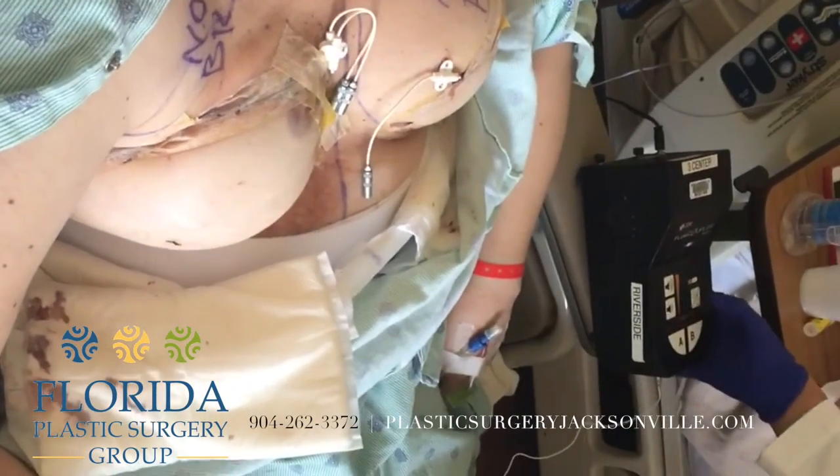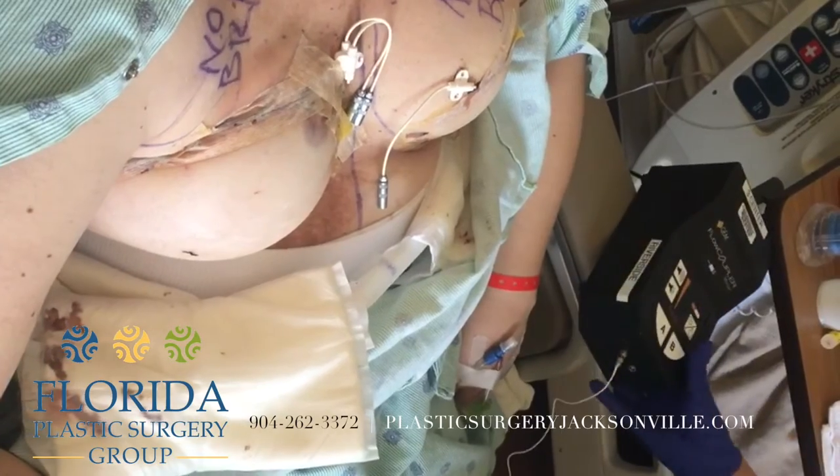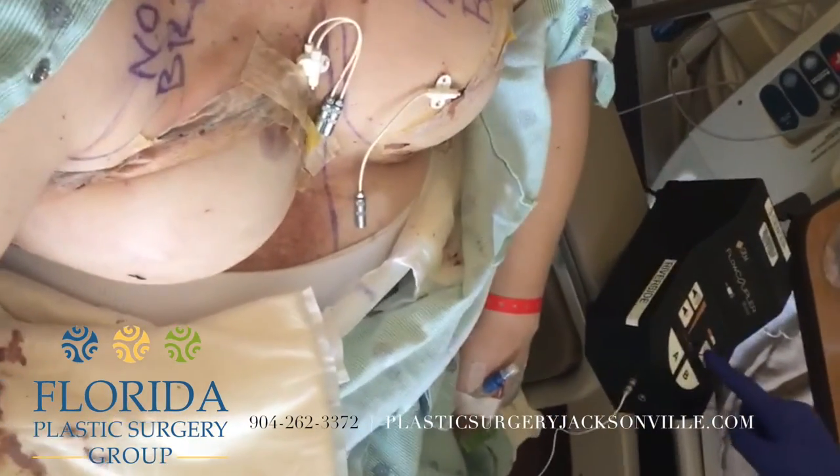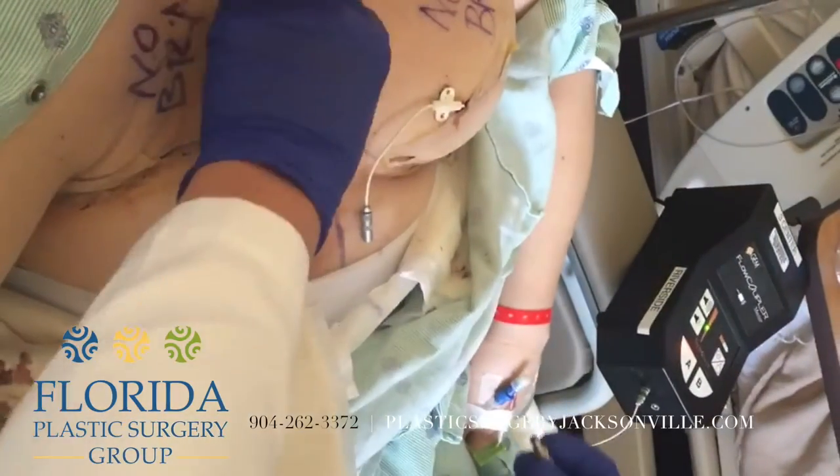This is a video on DIEP flap monitoring. First we're going to monitor the vein using this flow coupler device. To turn it on, you just press right in the middle of those two circles, and then you hook it up.